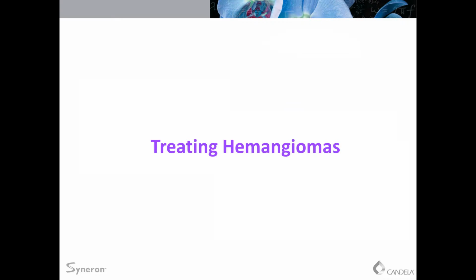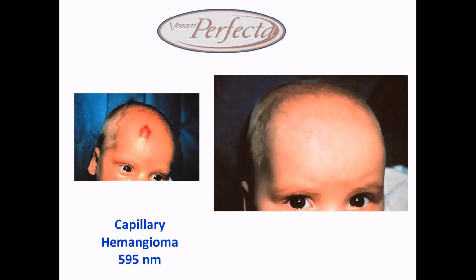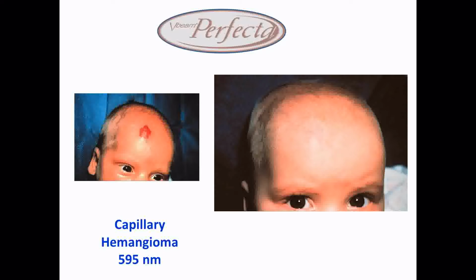What else can be treated? We can treat what we call Capillary Hemangiomas. Now, these are lesions, and I know there is a newer name, that names in dermatology are constantly changing, but I still think of these as Capillary Hemangiomas. These are the lesions that are not really present at birth, that grow very quickly. And then if left alone, within 2 years, they usually resolve. Parents aren't all that excited about having this big red lesion in the middle of the forehead of their beautiful young child. So what we can do is we treat these patients every 2 weeks, and within about 6 treatments, we can almost always get them to resolve.